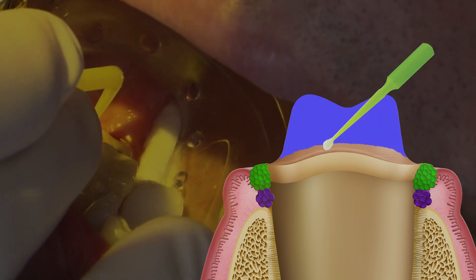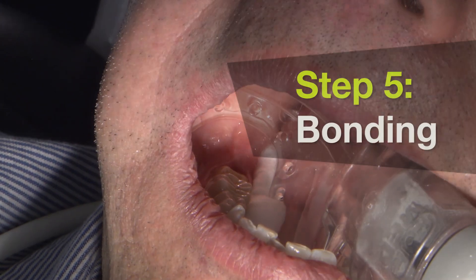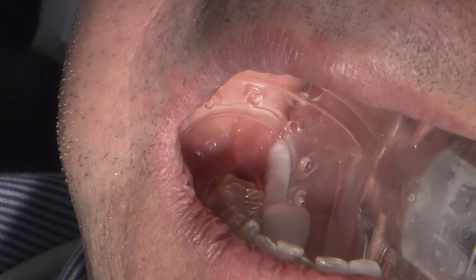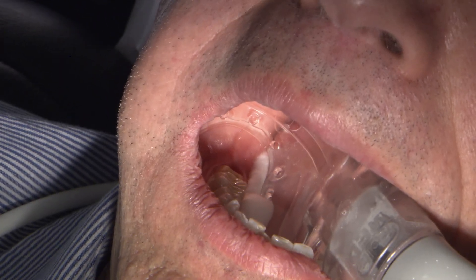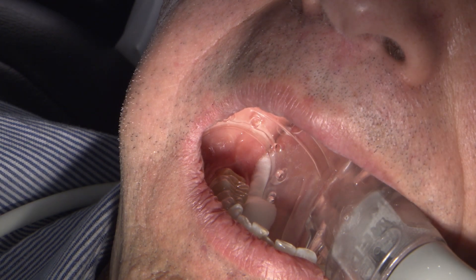To bond this restoration in, we're going to use 3M's Relyx Ultimate, which is their adhesive resin cement. The adhesive resin cement does require an additional application of a bonding agent onto the preparations. So using Scotch Bond Universal, we're going to apply a thin coat of the bonding agent.